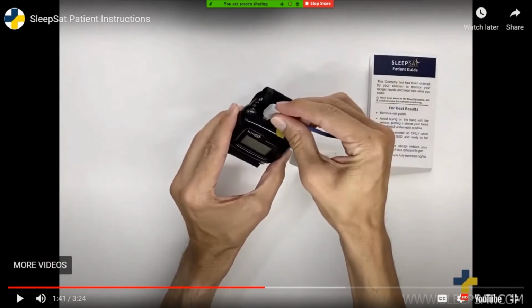All right, paused it at a bad time, but on the SleepSat probe, there is a specific orientation when plugging it in. There's a small bump on the quote unquote top of the probe and a cutout on the SleepSat, and you need to match those two up. If you're having to force them together, most likely the orientation is just wrong. Go ahead and flip it, make sure they match up, and continue plugging it in. When plugging it in, it should be firm. It's harder to plug in than, let's say, charging your phone, but otherwise you shouldn't have to monkey it in.